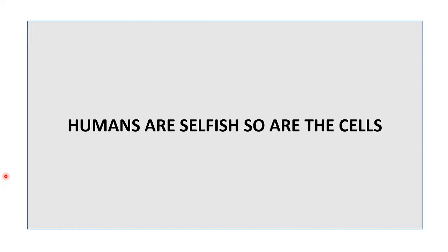Right? Contamination will obviously come. First time, second time, third time, you cannot stop it. But you can stop it by doing what? Practice. Good pipetting, practice. Sterilization, practice. Right? But if I tell you, from tomorrow you have to start the culture of B lymphocytes, you cannot do practice for that. Practice can be done with the technique. But to start the culture of B lymphocytes, what do you have to do? You have to learn about B cells. You have to learn about the cells' requirements.